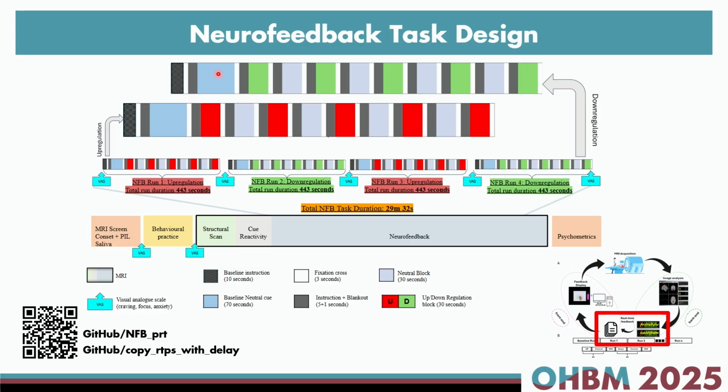This first blue block that you see here is the first baseline condition that we have. This first baseline condition is a bit longer. It gives TurboBrain Voyager proper time to find a baseline activation. Because keep in mind, whatever Brain Voyager wants to report to us is going to be a percent signal change of activity within that target region.